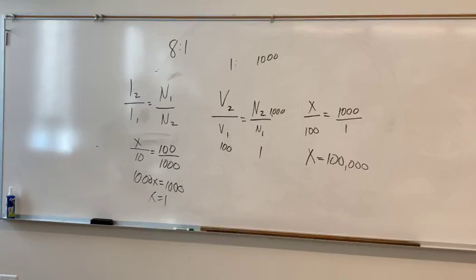So it's safe to say that voltage and amperage are always going to be inversely proportional? Yeah, yep. The only example where that might not hold true would be if you changed your resistance to compensate for one or the other. So if your ohms remain the same, then they're going to be inversely proportional. All right. Any other questions?